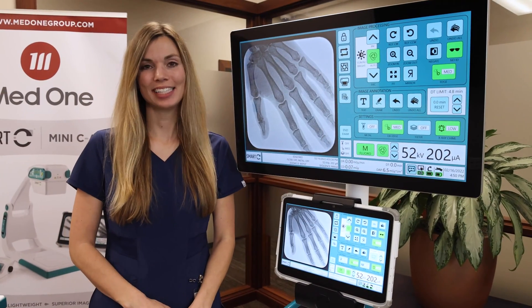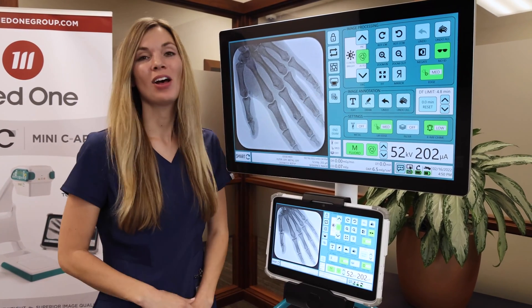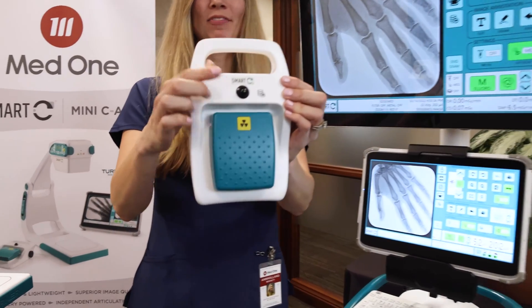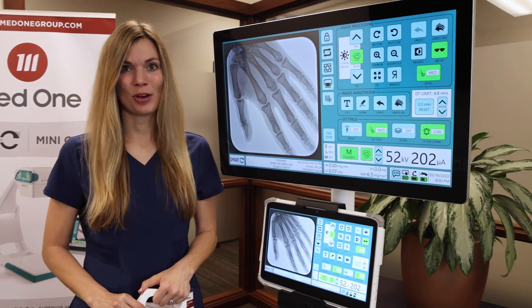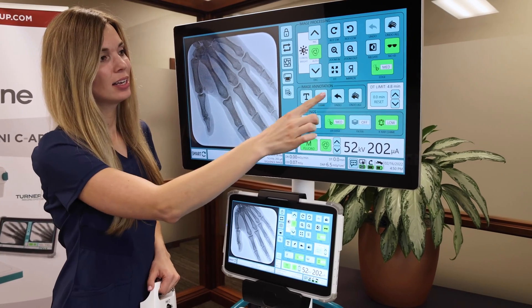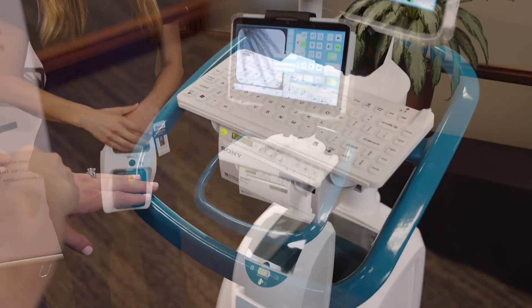Once you've made your desired adjustments, you can save your image by pressing the save button on the monitor screen, or you can press the black button on the foot pedal to save your images. If you would like to print your image, you can do so from the monitor cart. If you do not have the monitor cart, you can use another compatible printer.